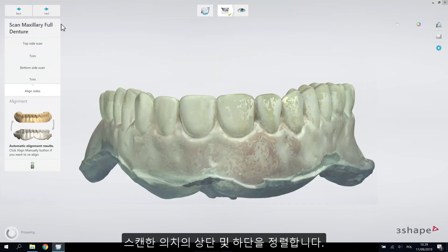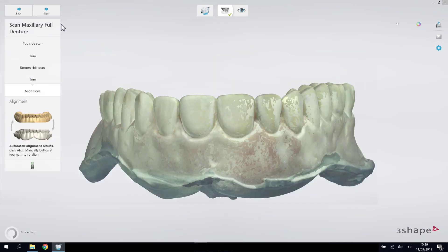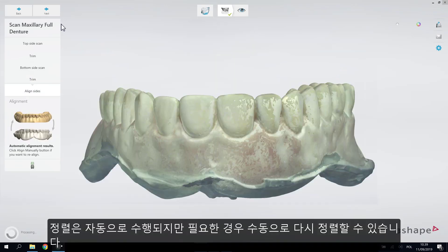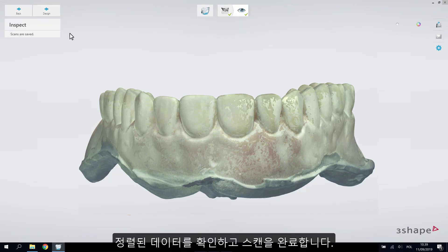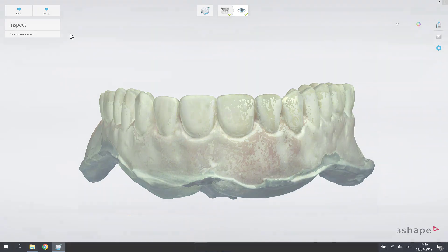Align the scans of the top and bottom sides. The alignment is done automatically, but you can realign it manually if necessary. Inspect the result and finish scanning.